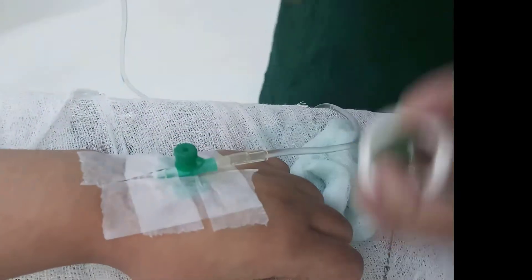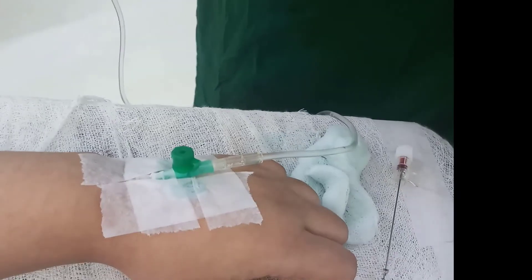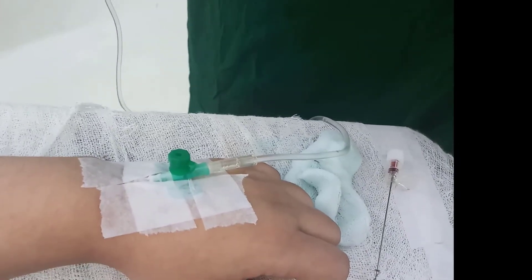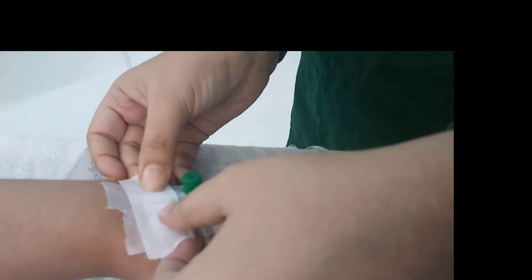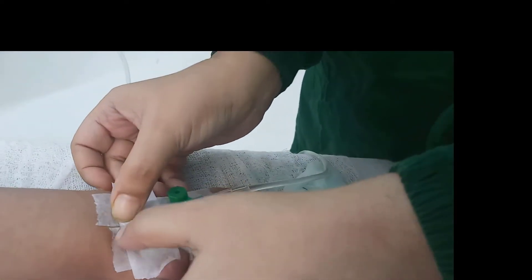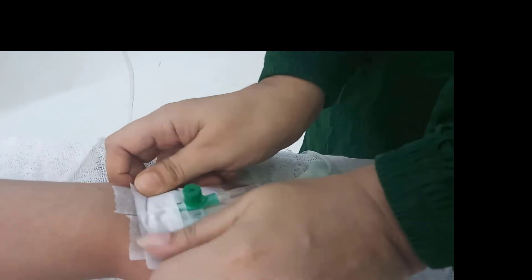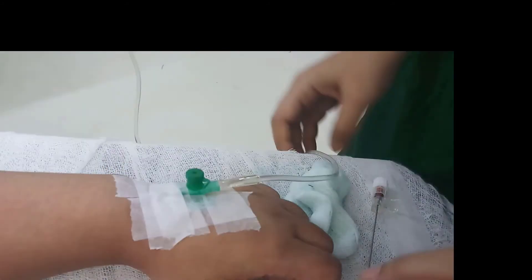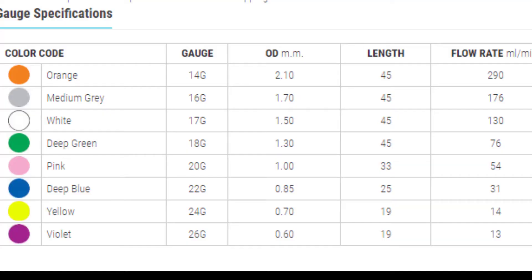There are different types of cannula which can be recognized by color. In the grounding department we usually use deep green, that is 18 gauge cannula, and pink, that is 20 gauge cannula.